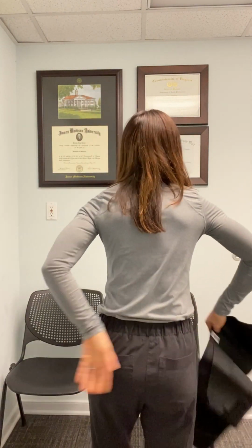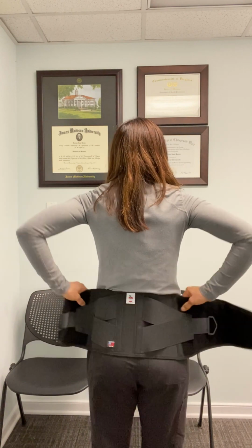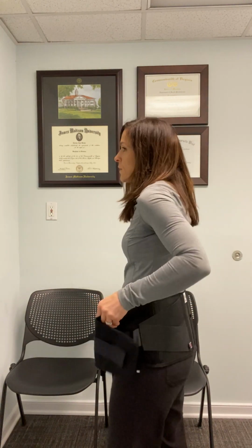So with the Core brace, you will see it has an Apple tag, which is for the back, and then it's got Velcro in the front. You'd open the Velcro first. Then you're going to take that Apple tag, and it should be in the back, in the center, and the brace should be, the top of my hip is right about here. It should be maybe an inch or so above the top of your hips.